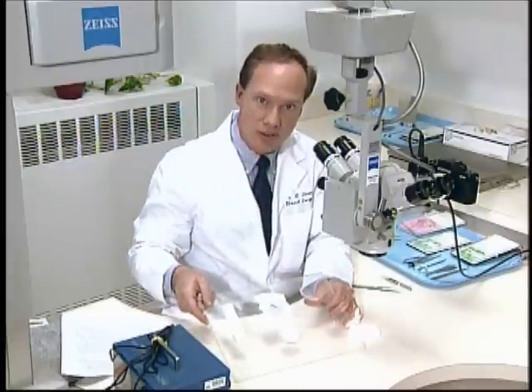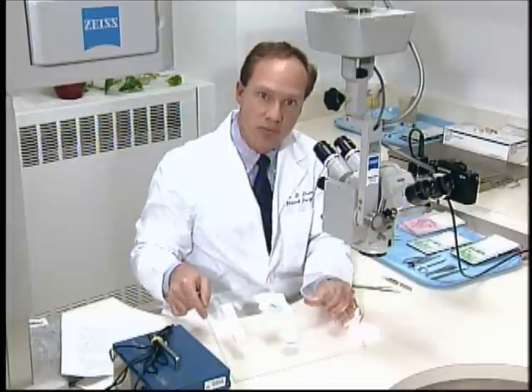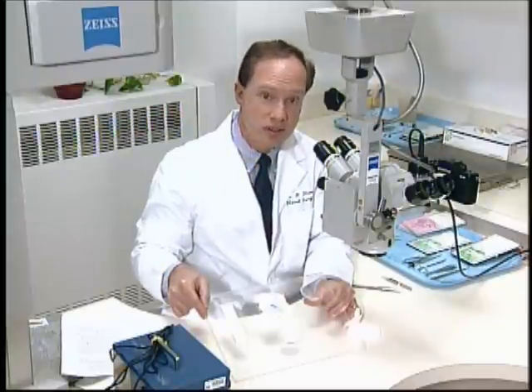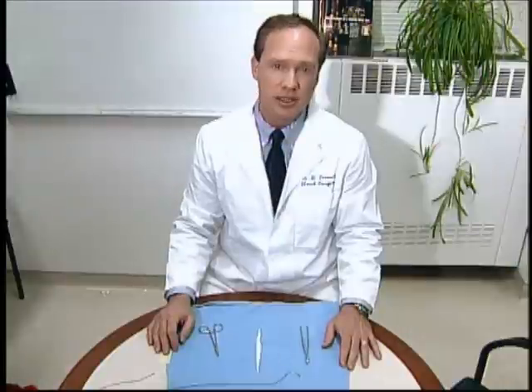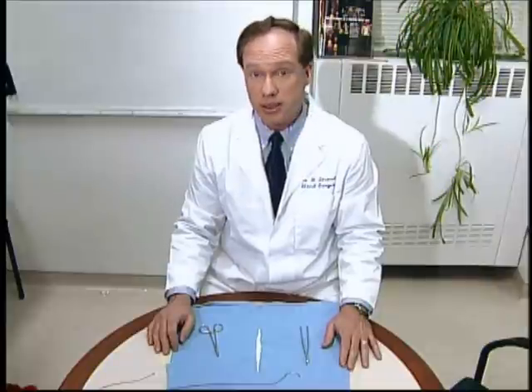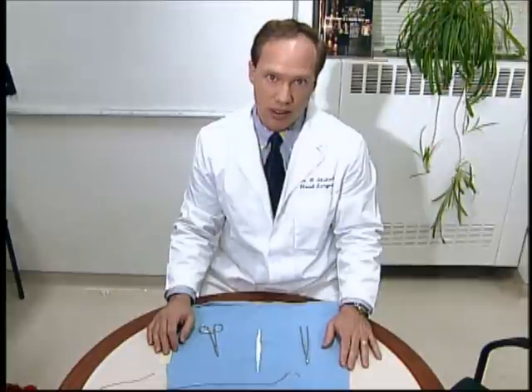Before we actually get started sewing on the practice model, let's review some of the basic hand motions and techniques for microsuturing, because this is different from the suturing technique you're used to in the operating room. It's important to review some of these steps to point out the differences between normal instrument tying and microsurgery instrument tying.